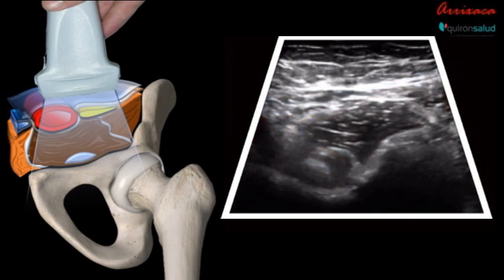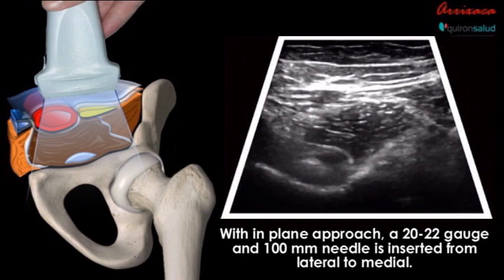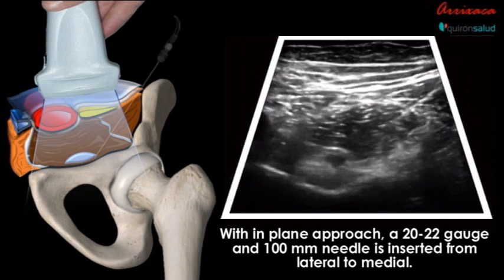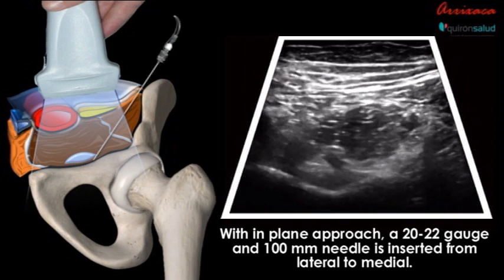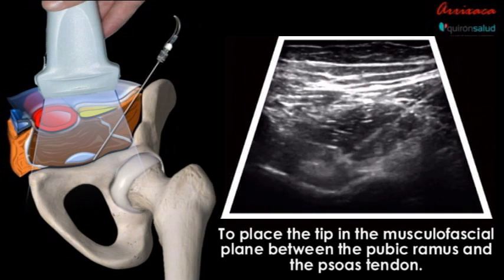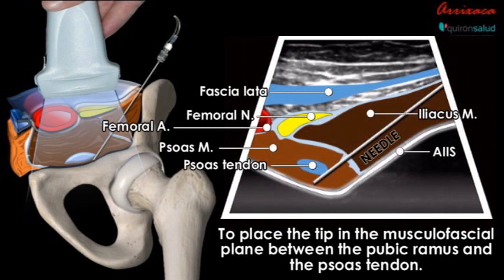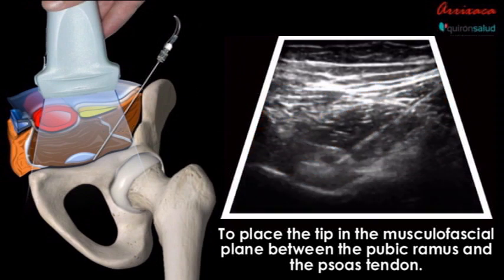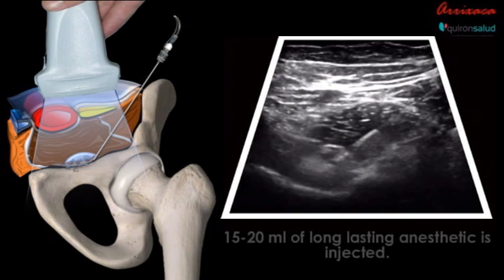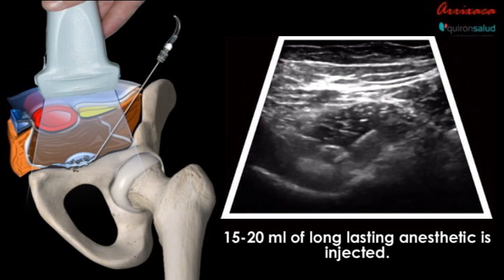We clearly identify our anatomical references again, and a 20 to 22 gauge, 100 millimeter needle is inserted in-plane from lateral to medial. We should be careful not to pass through the psoas tendon during puncture, depositing 15 to 20 milliliters of long-lasting local anesthetic between the psoas tendon and the pubic ramus, while observing the displacement of the psoas tendon.